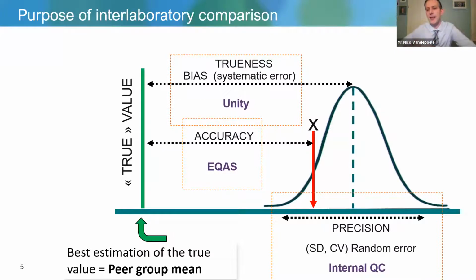And when you look at a daily QC Interlab program, you actually compare your mean to a population, which is a difference because that mean value is a closer expression of what your target really is that you measure. So it would almost be, and I don't like to say it because I'm confusing things then, but the more you would measure a result, the more you get closer to a trueness estimation than an accuracy estimation.